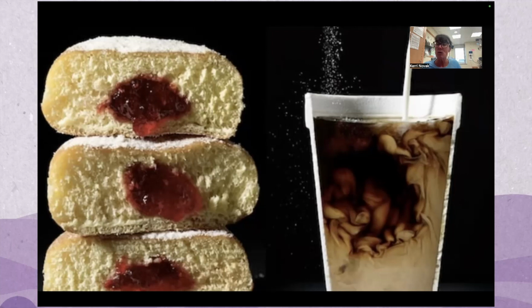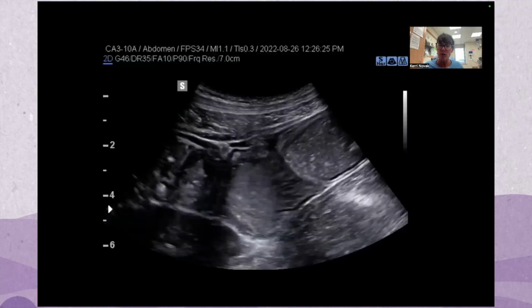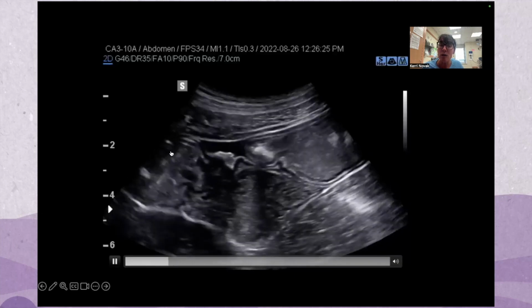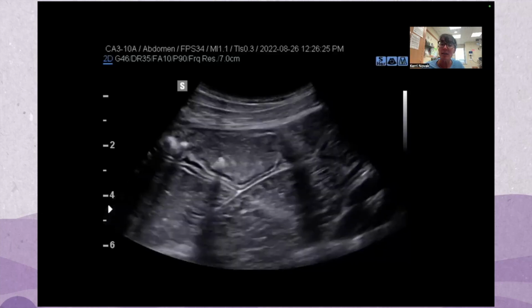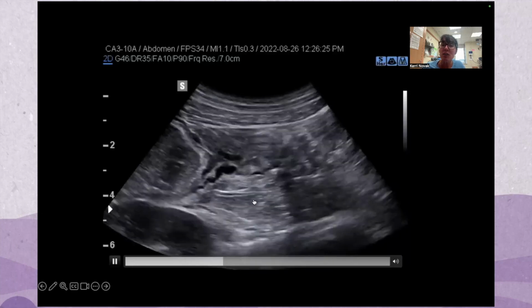And your symptoms certainly can be from a myriad of things that don't necessarily reflect what's going on inside your bowel. Here's an example. So this is small bowel. Here's the kidney in the very low pole, and you see the contents swirling. These are all loops of bowel that we're looking at end on in cross section. And this is muscle here. This is the psoas.